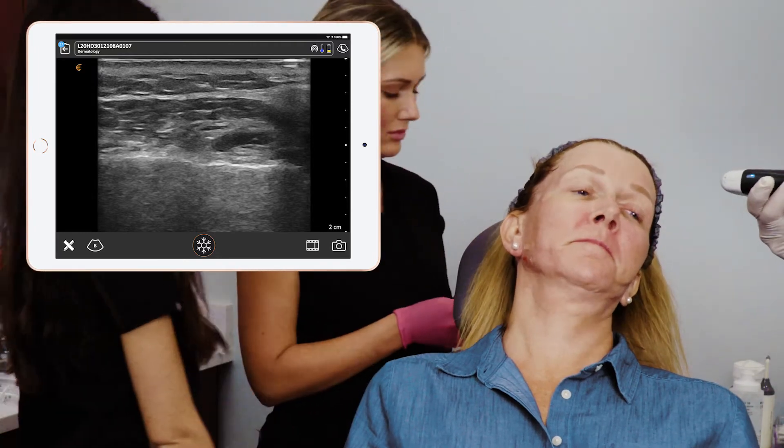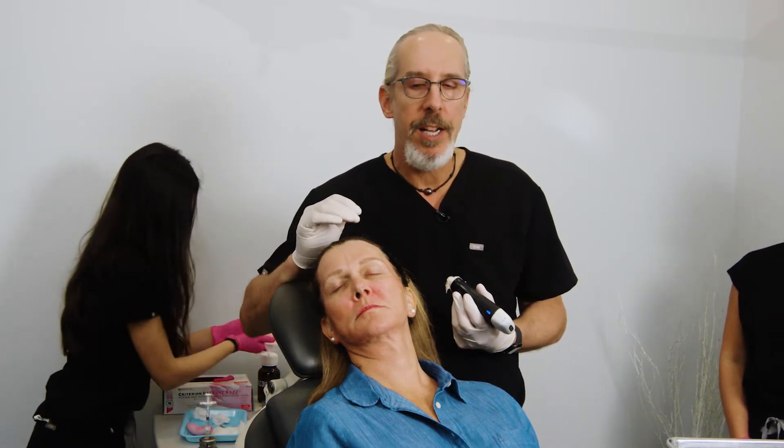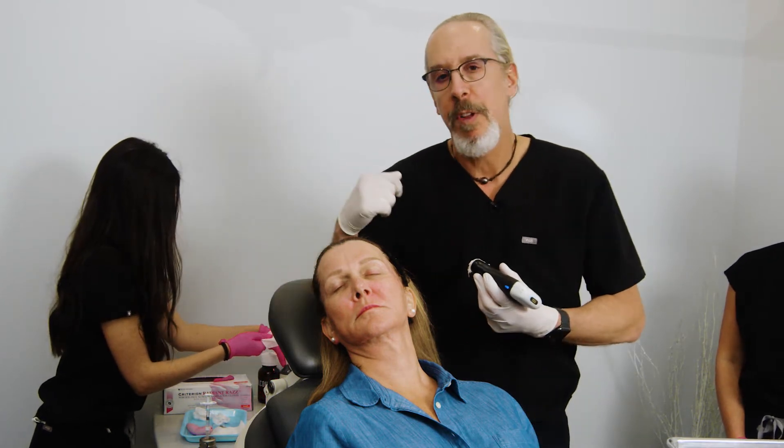How did it feel? Pretty easy, right? I highly recommend incorporating jawline injections into your practice. It's a fairly easy injection, very low risk, and it has significant changes to the patient's beauty.